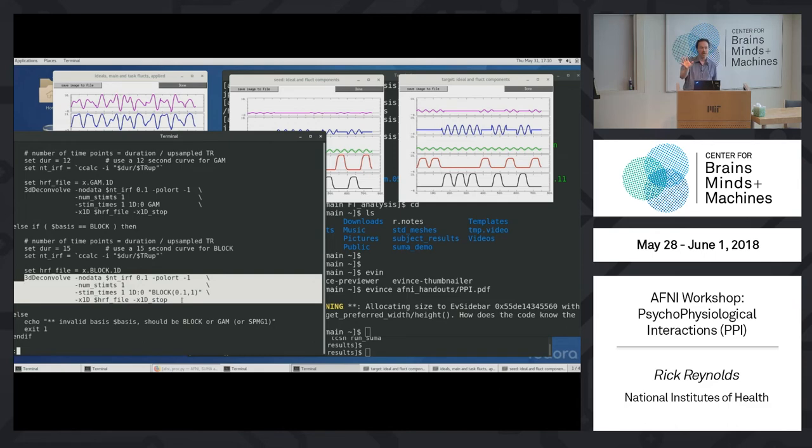Other software packages may restrict themselves to BOLD-like signals. We don't go after that. It's nice to have this invertibility that gives a robustness to the method. So we're going to rely on the censoring and the motion parameters and stuff like that to work like they have been already. We'll just let the data be what the data is, pass it through the PPI filter, and hope it comes out well.